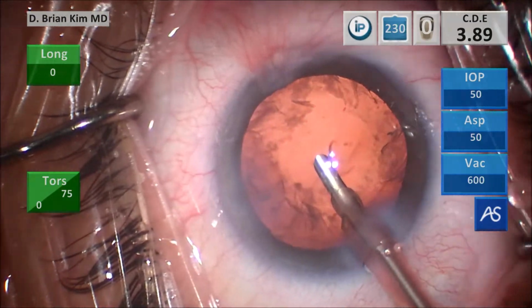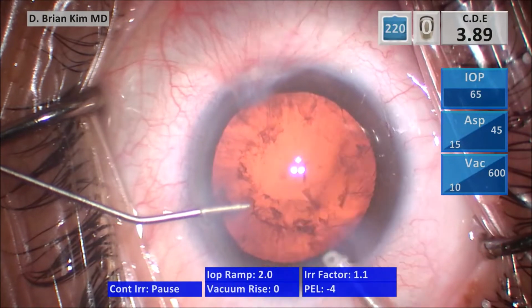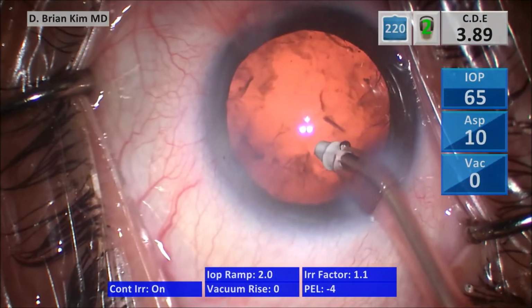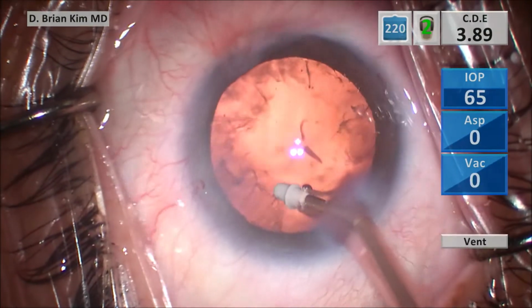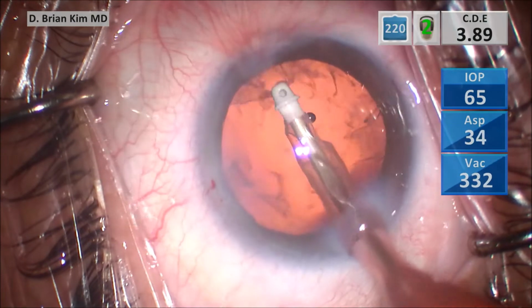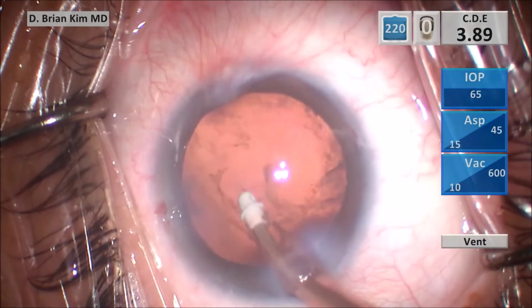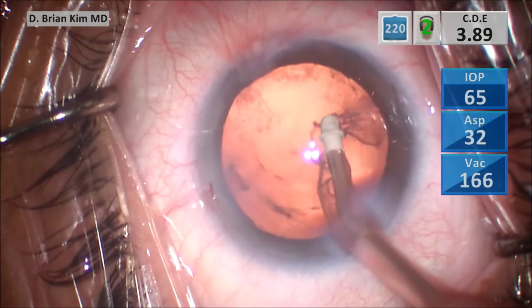So I take the chopper out, push BSS in, take the phaco tip out, and I go in with the I/A handpiece. I always start subincisionally, trying to remove the cortical material from anterior to posterior. By doing it this way, you get a cleaner removal of the cortex. But of course, sometimes it doesn't come out completely cleanly like that, so you'll have to go out and start to polish.